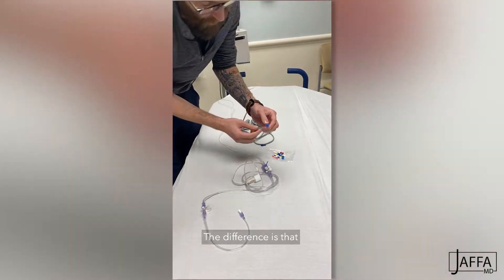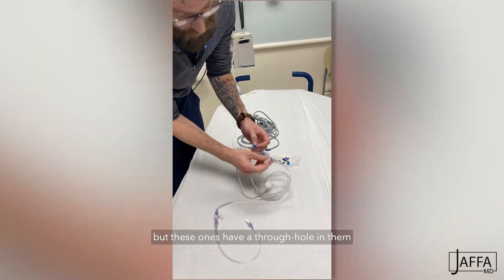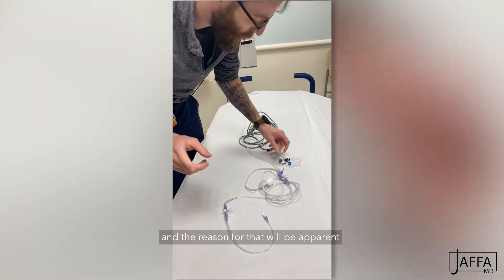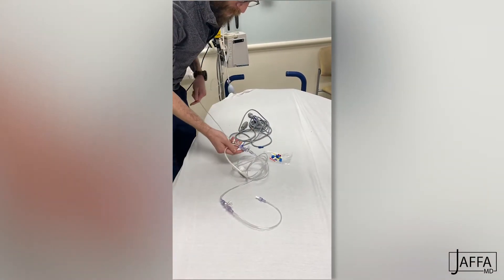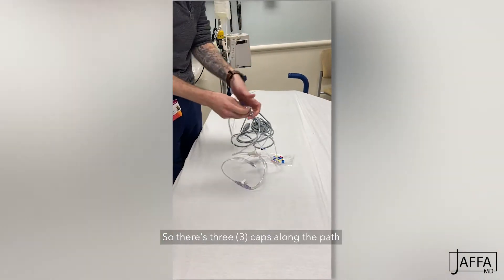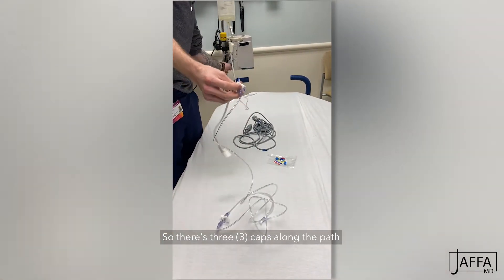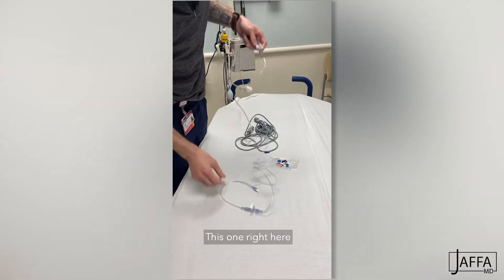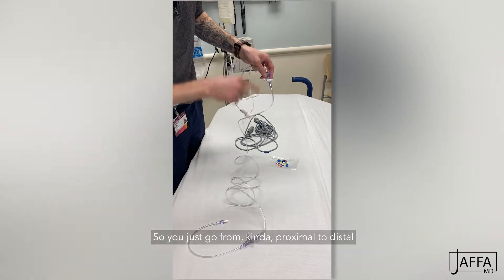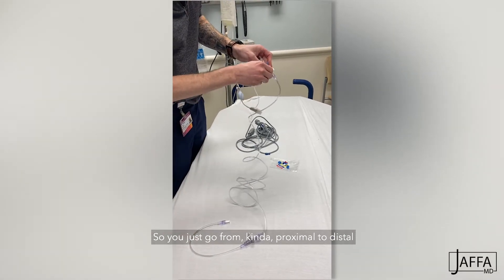The difference is they're giving me a different color, but these ones have a through hole in them and these ones do not — they're just a dead end hole — and the reason for that will be apparent. So this is obviously for the connector here. There are three caps along the path: this one right here, this one right here, both with little three-way stopcocks, and then the end one right here. You just go from proximal to distal.